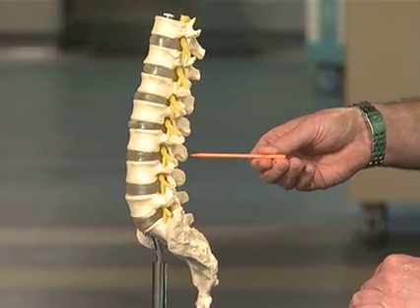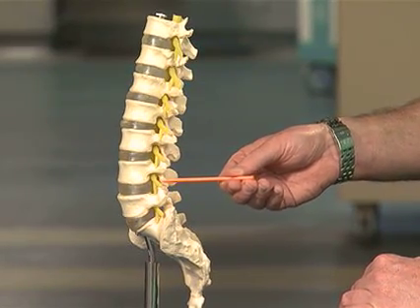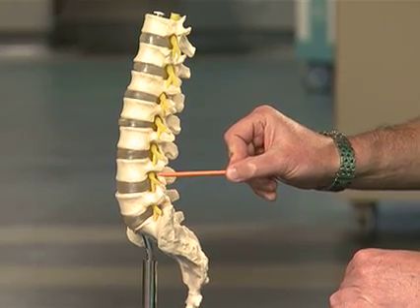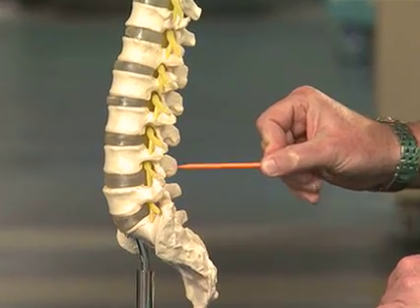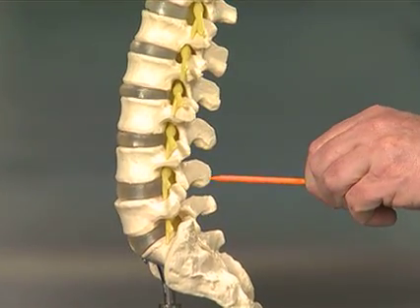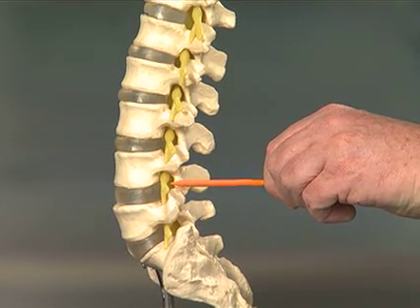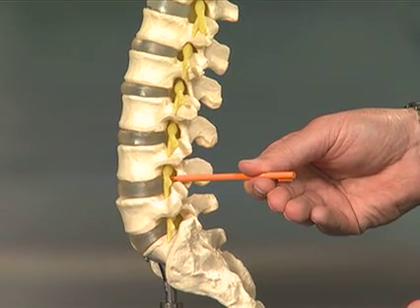Oftentimes, the disc herniation or the pathology in the spine is limited to one level of the spine on one side affecting one nerve root. In that instance, we will take our needle, come off the midline, and direct it towards the nerve root that we're interested in, once again into the epidural space.